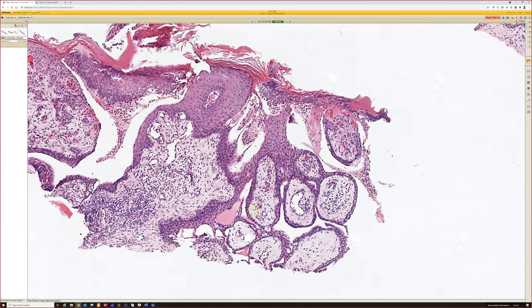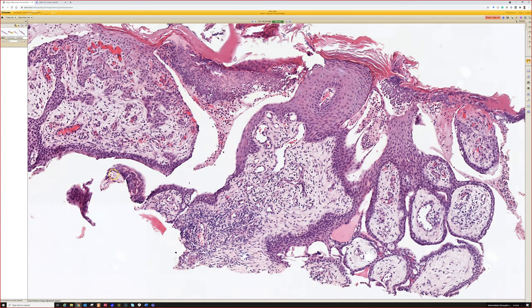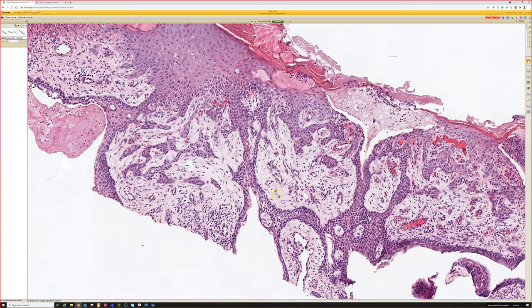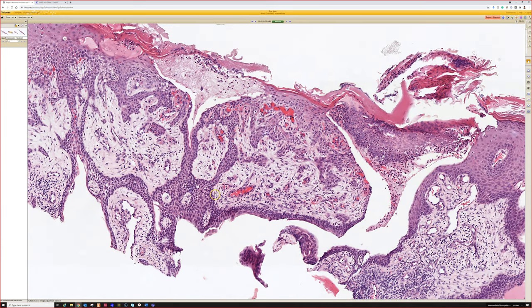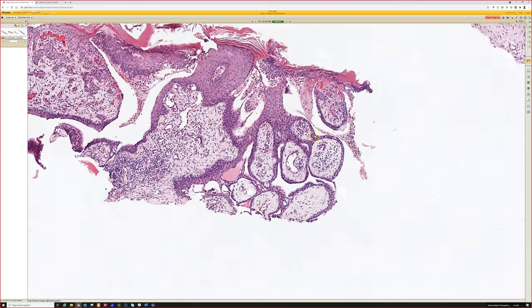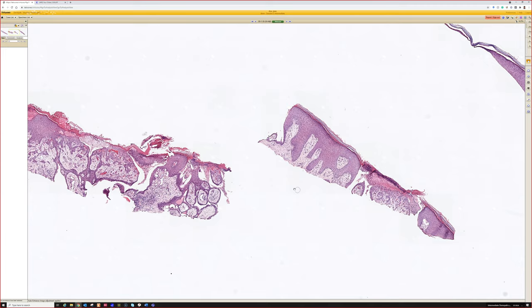The other thing you could think of here is it has a little bit of overlap with syringocystadenoma papilliferum, right? And you could also think a little bit of a poroma, although in poroma, I feel like the fingers that come down are much broader and wider, and these are very thin, narrow strands that come down, and each one has a nice duct lumen. Whereas in poroma, you often have to hunt around for the ducts. Here, every single strand has a dilated space in it. See, there. It's like all the acrosyringia fusing together. So syringofibroadenoma or acrosyringeal nevus, if you like.